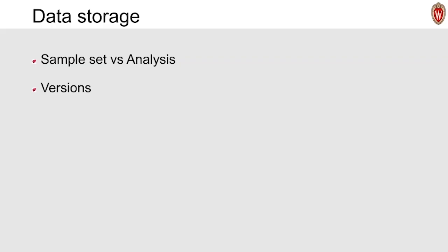So now when you save those files, you're not overwriting them, you're creating new versions. So each of those files you make add up. The tricky part is that each full save is a duplication of those files. Every one of those versions adds on another 10 gigabytes or 25 gigabytes for each of those analyses. Usually you don't make multiple of the same sample set, so those will stay pretty solid at 7 or 8 or 9 or 10 gigabytes. But every one of those analysis saves is going to be another 25 gigabytes in positive mode, 10 gigabytes in negative mode.